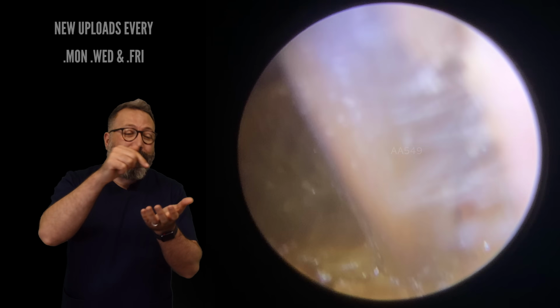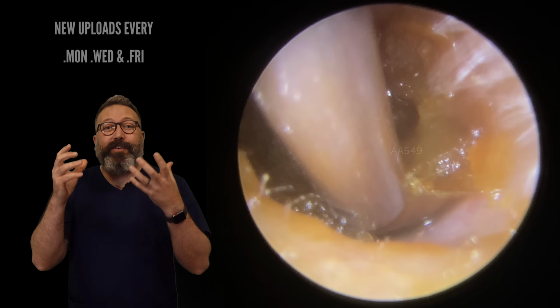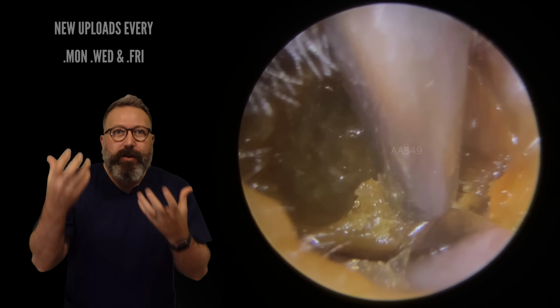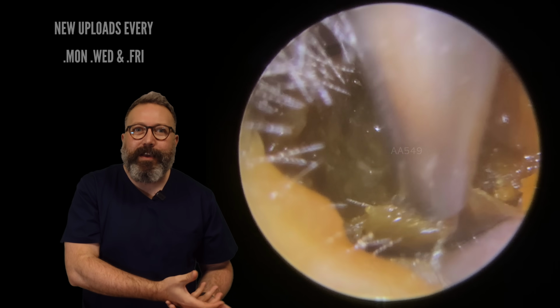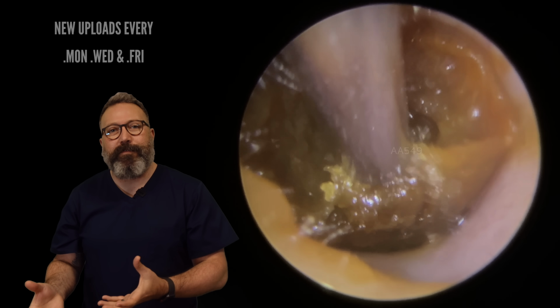And you go back in, you find these big old chunky bits left down in there, and it makes a massive difference. There was an audible difference. The patient really expressed how much more they could hear when that last little bit came away. So it looks like nothing from the surface, but it was making such a big impact further in.